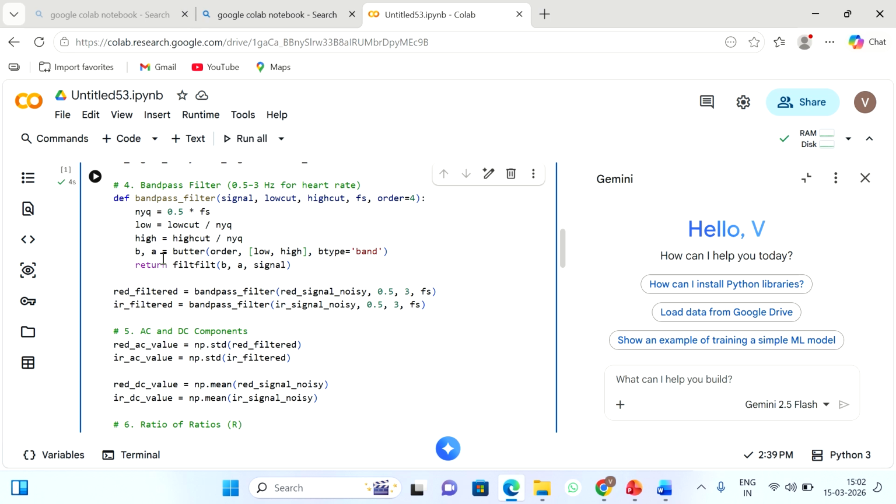It will return a signal of good quality. Then red filtered is equal to band pass filter applied on the red signal noisy, with cutoff frequency 0.5, 3. Already we have decided the sampling frequency FS, and it is normalized. Then for IR, whatever processes we did for the red signal, the same thing is applied to the IR signal also. So the band pass filter is applied to the noisy IR signal, with cutoff frequency ranging from 0.5 to 3, and then the sampling frequency.